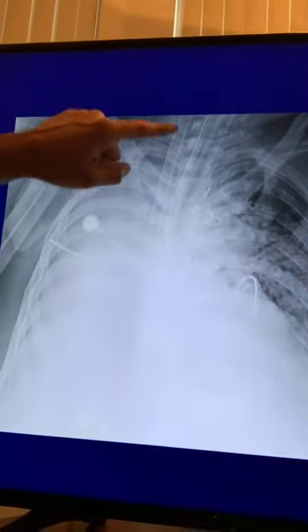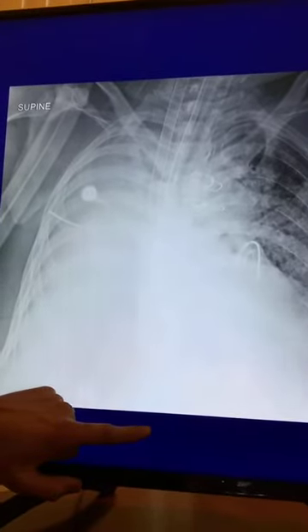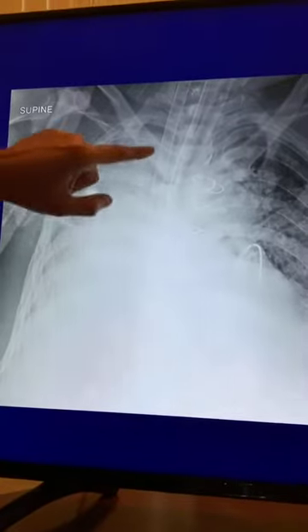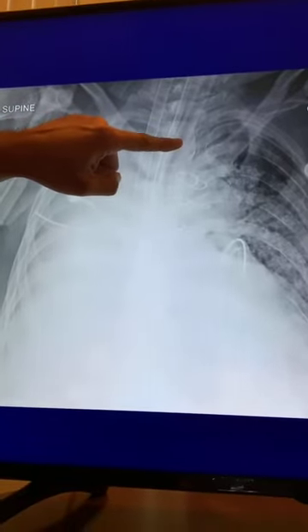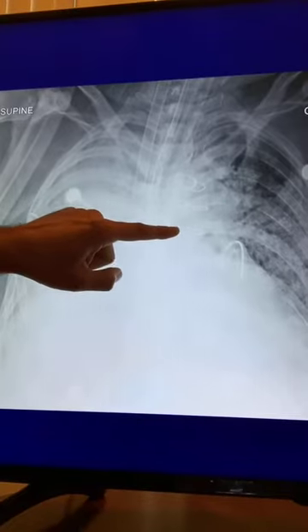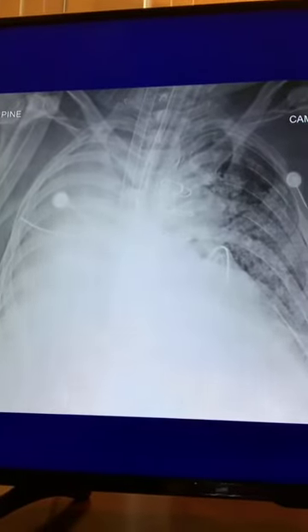But if you ever see a big old catheter going from up here, from the neck, going all the way below the confines of the examination down here, think about an ECMO catheter, all right? And if it's on the venous side, beautiful. Remember, the ET tube should end above the carina somewhere, but look, they even put another little piece right here and they selectively intubated that mainstem bronchus so the whole other lung is completely collapsed down, all right?